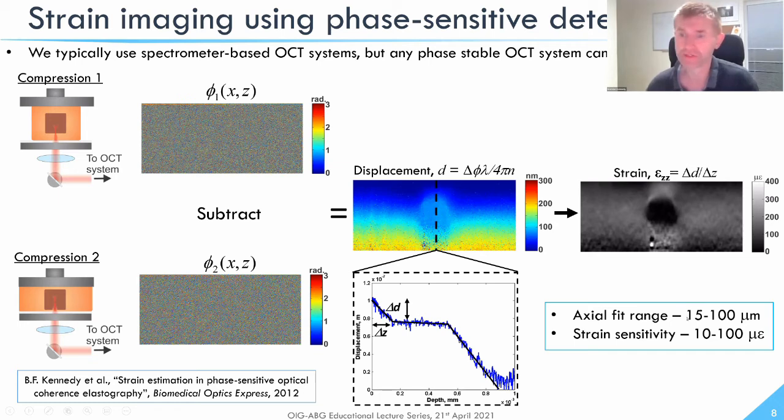That would lead to the highest resolution. The challenge is that when you've got speckle in OCT images, in dark speckle, where there's a low OCT intensity, your accuracy in the measurement of displacement is quite low. So we usually need to perform this fit over several speckles. Then this just illustrates how we can do that in 3 dimensions as well.